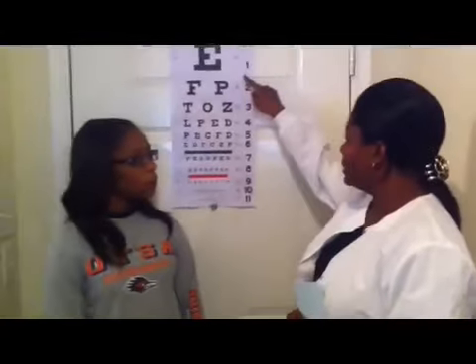So basically, we're going to start with assessing your eyes. This is called a Snellen chart, and basically it's just to tell me more about your vision. And for this, I'm going to have you use this index card. We'll walk over there, and I'll have you cover your left eye with the card, and I'll point, and just try and read as much as you can without straining your eyes or without using a lot of effort to read, okay? Yes, sir. And I see you're using glasses. Is your glasses for reading or for vision? For vision. Great. Okay, we'll walk over to this part, 20 feet.